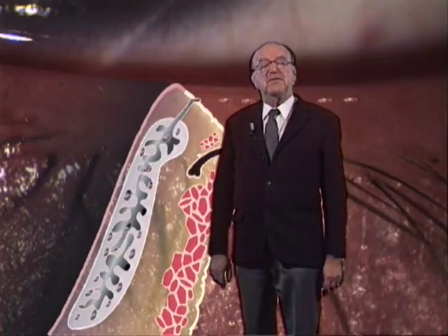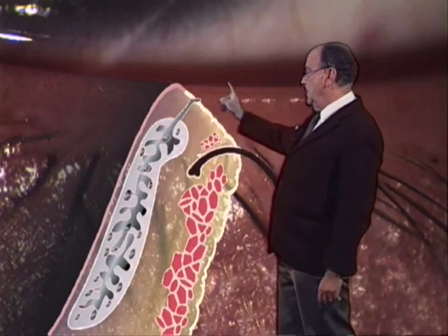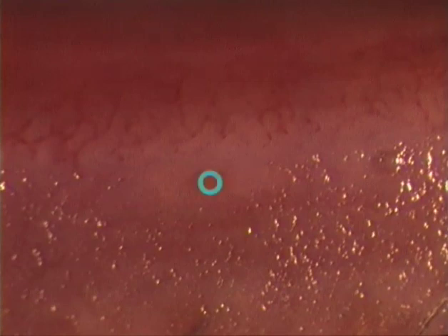When we evaluate the tarsal glands, the main clinical criterion is the patency of their orifices. The orifices of the tarsal glands appear as a row of dots, with a small lumen filled with bright secretions in the center, a darker surrounding rim of epithelial lining, and a more or less distinct brighter halo of the tissue surrounding the epithelial lining. And here, the corresponding wet specular reflexes, showing, by their width, the extension of the secretions into the surroundings.